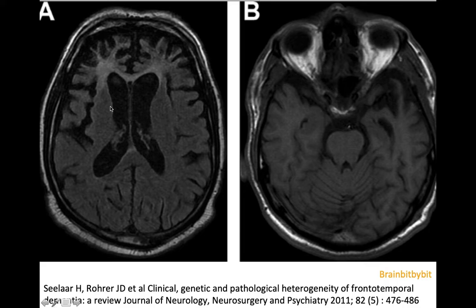On the left side there is a FLAIR image of a patient with marked frontal atrophy and also gliosis in the white matter, which is consistent with behavioral variant frontotemporal dementia with behavioral problems. Pick's disease is also included in this image.